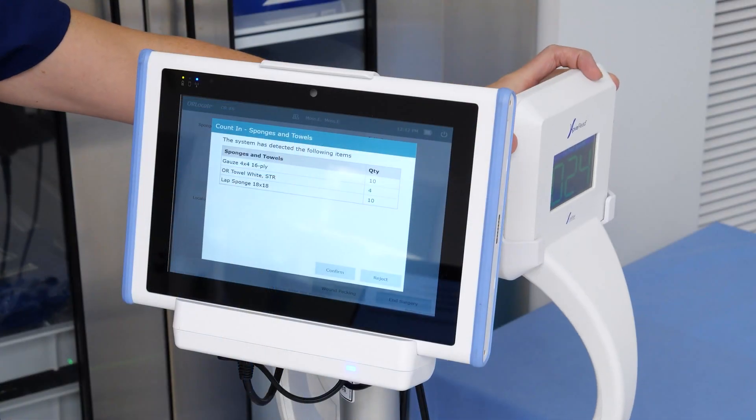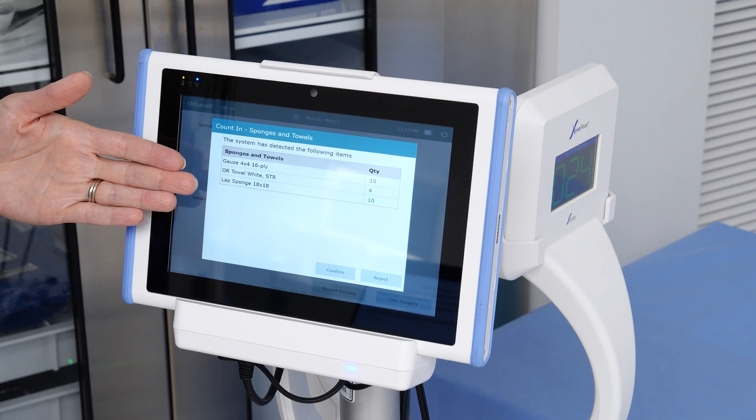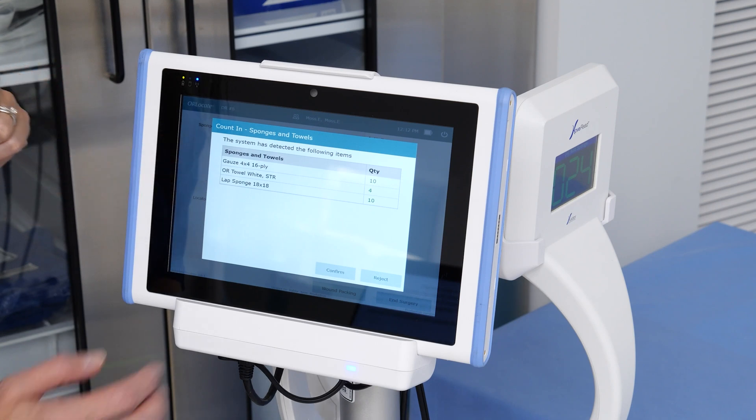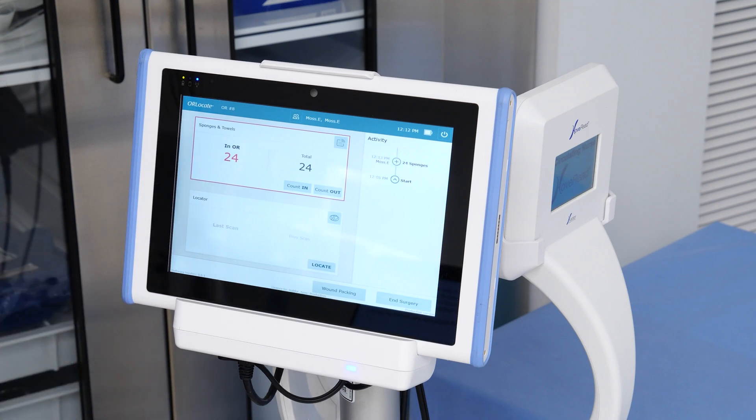The back of the HoverRead will show the total number of sponges counted in. The Panel PC will show a detailed list of the different types of sponges and towels scanned. When all items are scanned in, press the confirm button on the screen and the total is shown in the sponges and towels window.